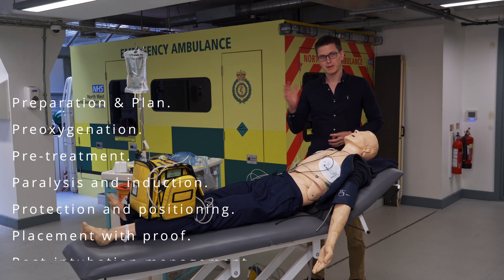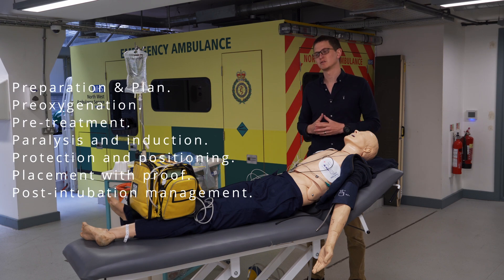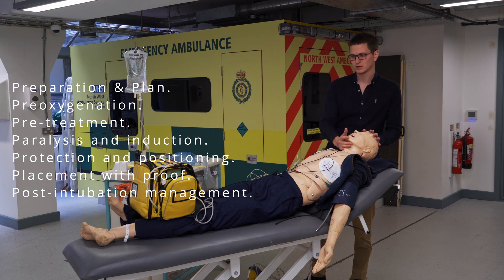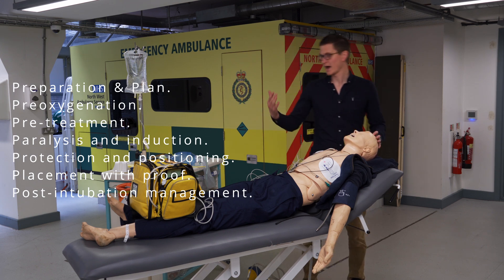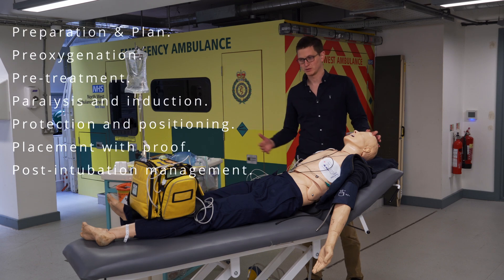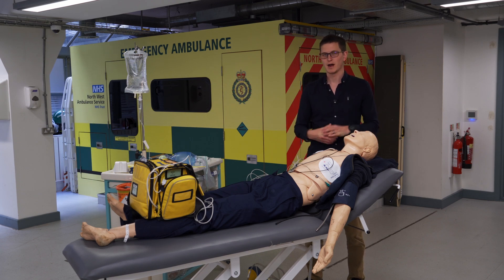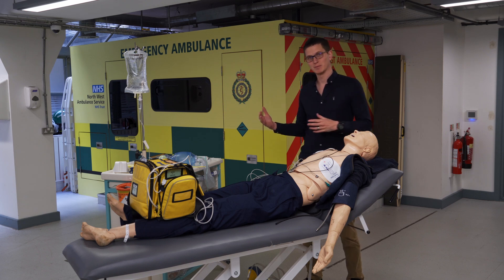The first P is always going to be prepare. We need to prepare the team, prepare the patient in terms of positioning, drugs, equipment, and IV lines, and we need to prepare our equipment — make sure all our kit is set up and ready. So let's go through: am I prepared? Is my team prepared?